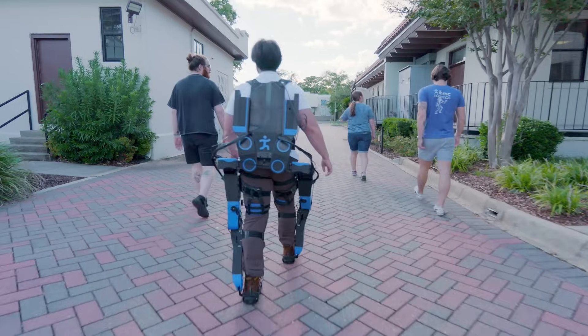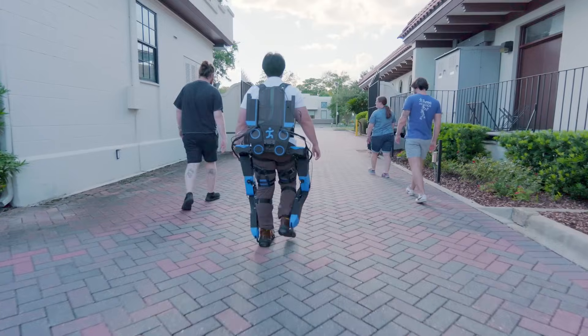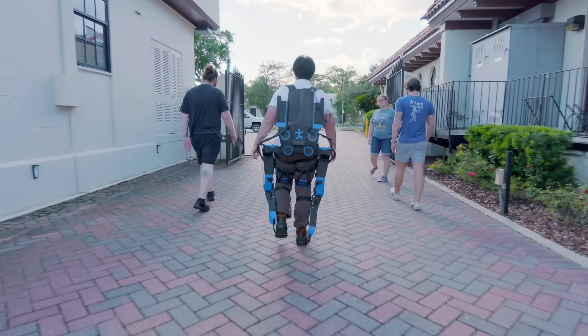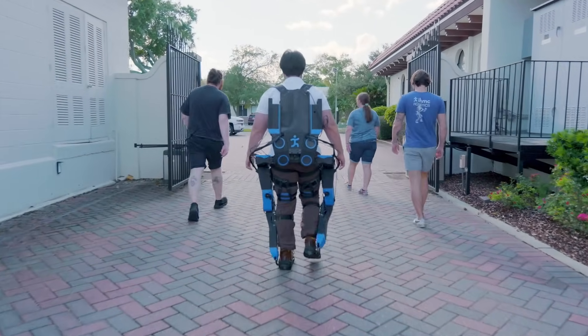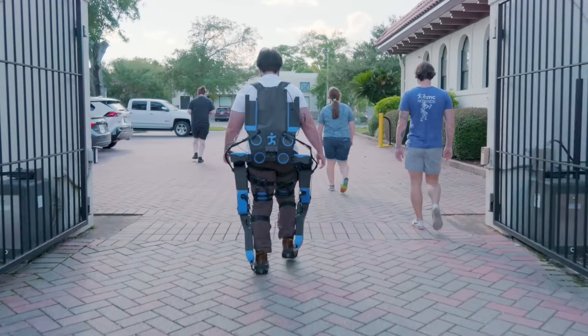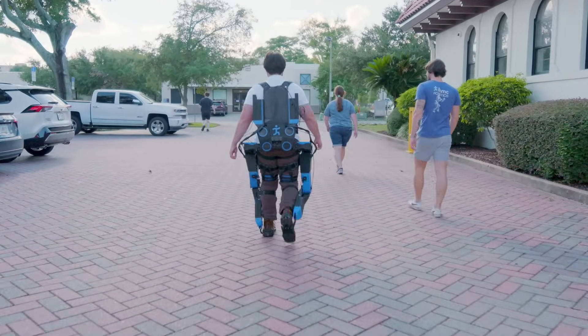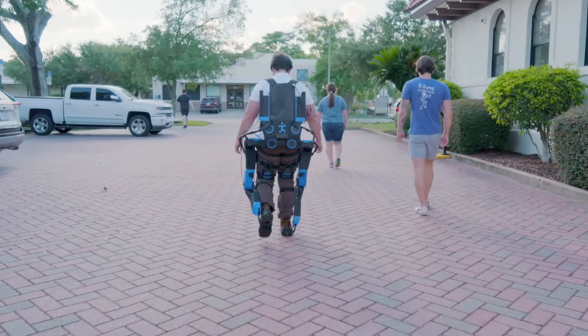Another cool part about AVA is that it's highly adjustable. All the people you see walking with me right now — we've fit this device on each one of them, going from around five foot five inches to six foot seven inches. And even in those ranges, it's still not at its maximum settings, so it can be fit to a lot of different types of people, which is another main novelty of AVA.